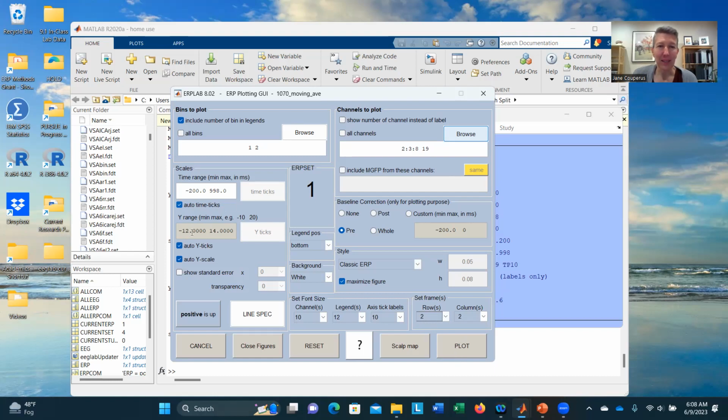It will automatically set a range, a Y range, and an X range. The Y range, you may need to change this, particularly if you're showing all 32 or 30 channels or 60 channels or however many you have. If it includes the eye channels, those have really big activity sometimes, and it'll automatically set the range so that everything else looks flat. And so you might need to, instead of having an auto Y scale, not the ticks, the scale, you might want to change this. If this looks like something like negative 100 to positive 200, you're not going to be seeing your brain activity. So you want to make sure this is in a range of, somewhere on the order of negative 25 to 25 at the most, so that you can actually see your brain activity. Most of the time, the auto scale is fine, but that's just something to note. If your data looks funny, go look at your scale.